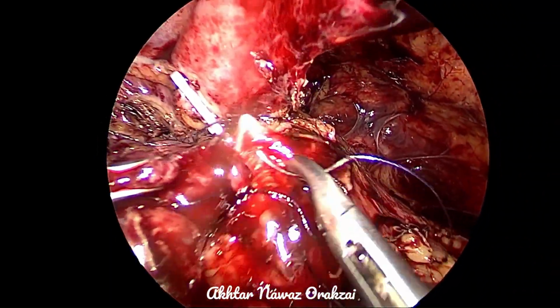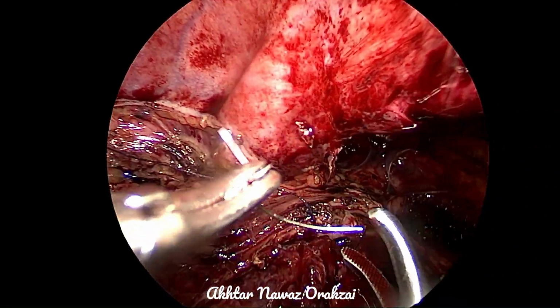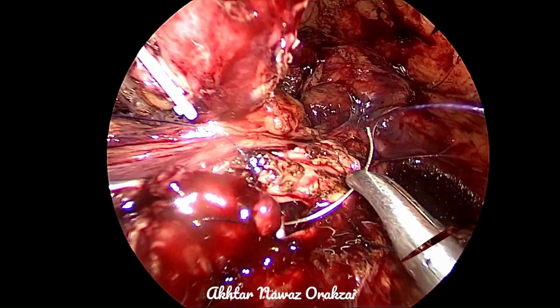In the meanwhile, once again, the assistant can irrigate and do the suction to clean the area.